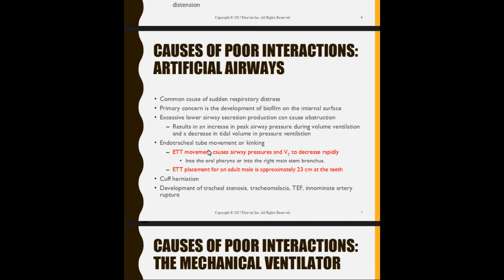You're possibly causing some alveolar trauma, volutrauma, barotrauma. There's a whole lot of trauma going on. Okay, and that's what's going to mess up the patient. That's going to cause an ALI. ALI can possibly lead to ARDS. And now you've got ARDS to deal with, on top of the patient not responding because they are asynchronous to the ventilator. So you can start to see the buildup of issues if you are not cognizant of how the patient is breathing on the ventilator.